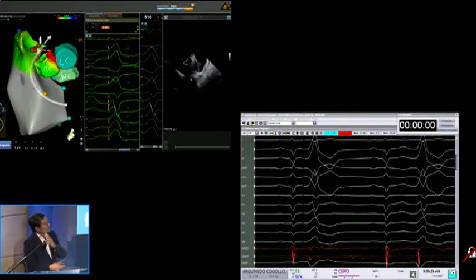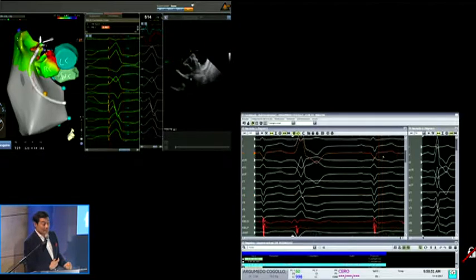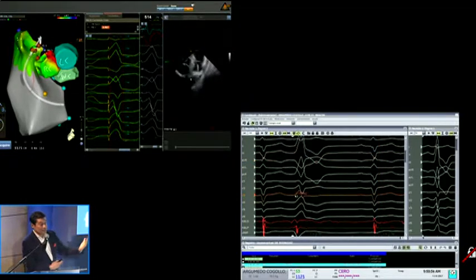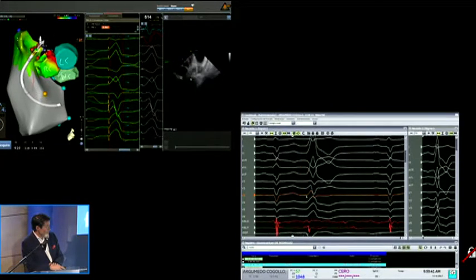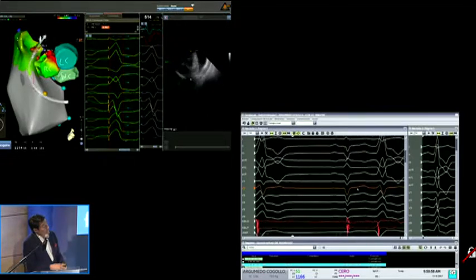Please place it in the review screen for the polygraph. You may be at the exit but not the origin. Yeah, here we need more support because the electrogram varies a lot. I cannot get a good measurement here. Please update.